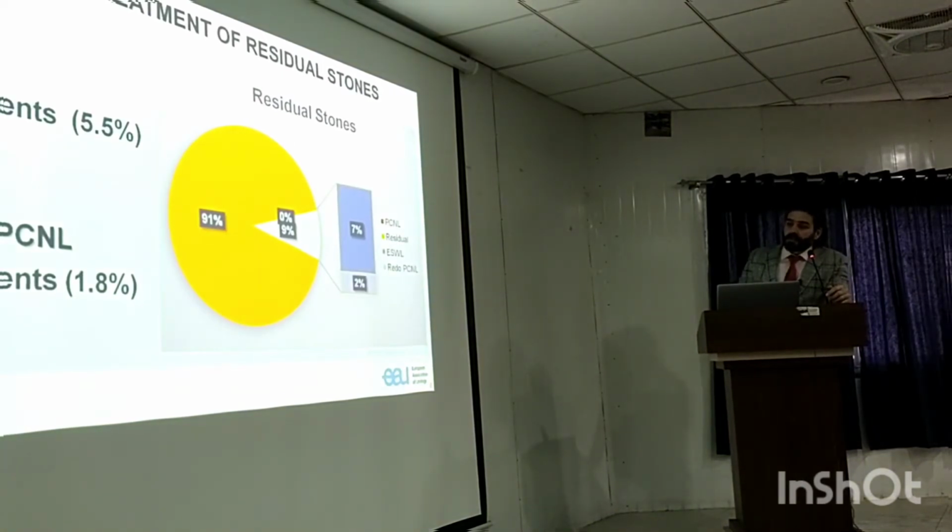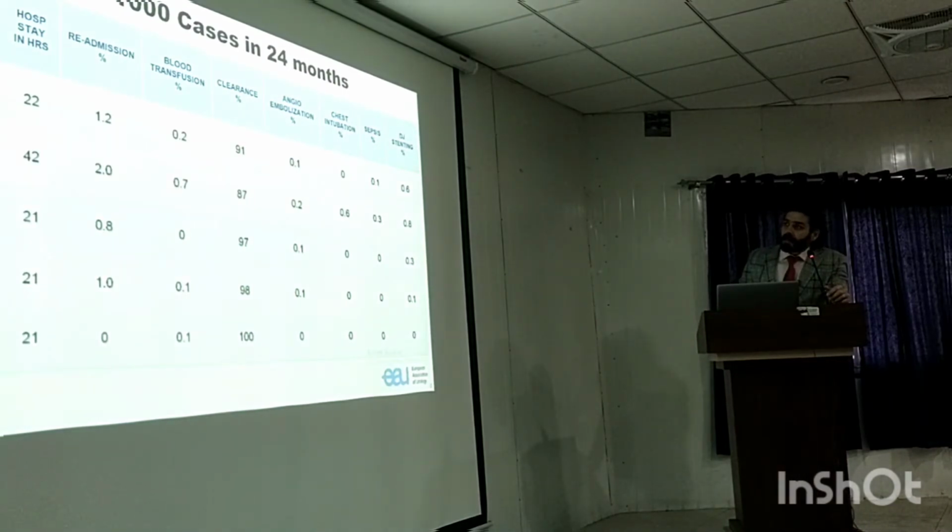So for residual stones, as PCNL got a 93% clearance rate, there is still a chance of residual stones after PCNL. So 55 patients underwent ESWL and 18 patients were subjected to redo PCNLs. This is 1,000 cases in 24 months. This is the whole data for partial, complete renal, pelvic, lower pole and horseshoe kidneys.